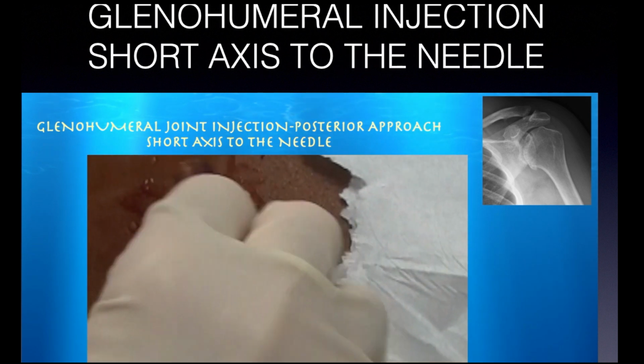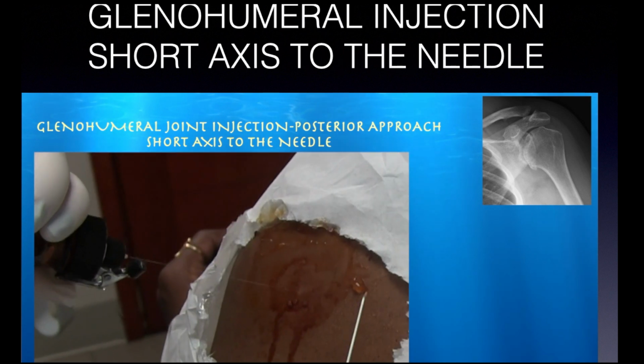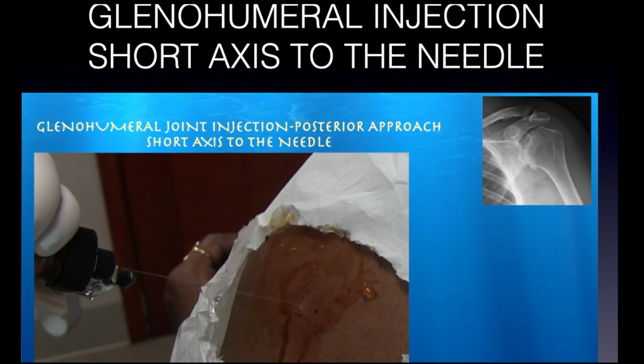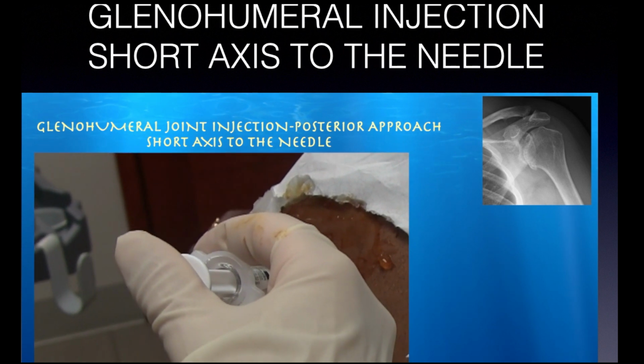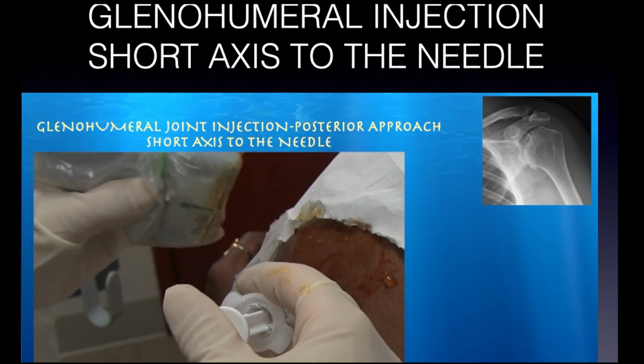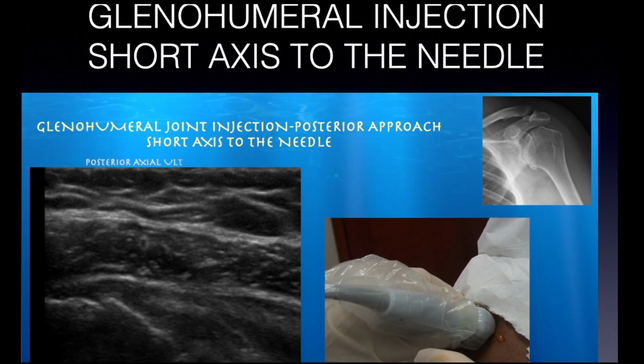Okay. And we have, I think, at least one surgeon in our team today. So I'm sure the surgeons want to see the procedure before the procedure is done. So here we're going in. This is viscosupplementation for the shoulder. And here it looks like my needle was underneath the probe on this particular procedure.